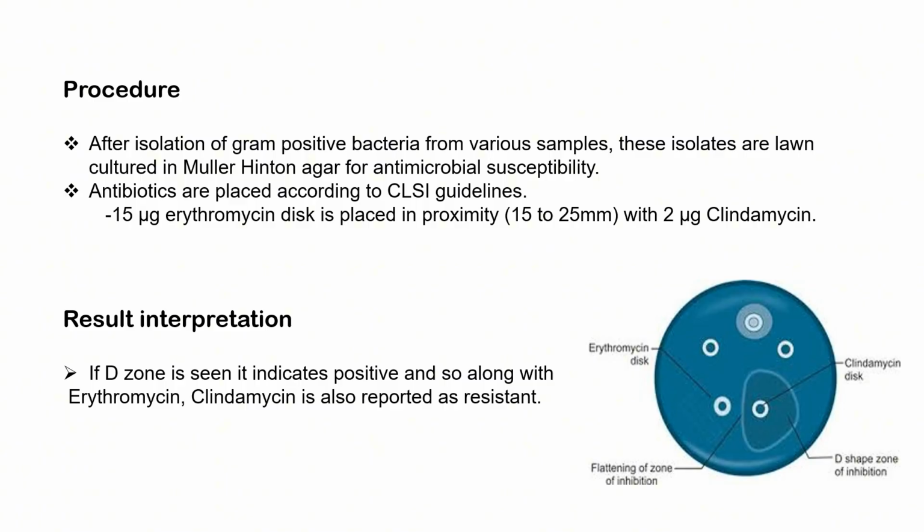It can lead to treatment failure if not detected. The D-test is a simple and effective method to identify this resistance.